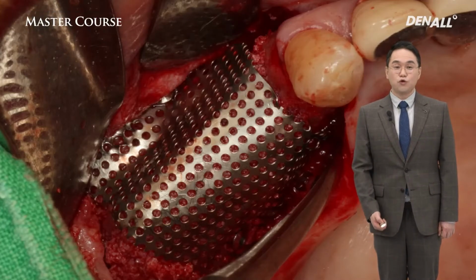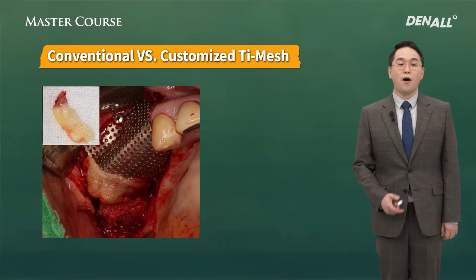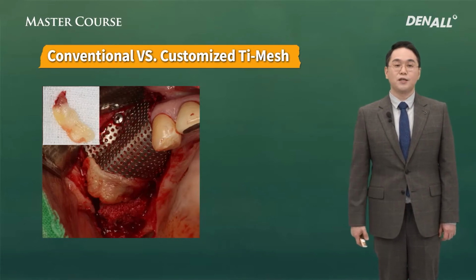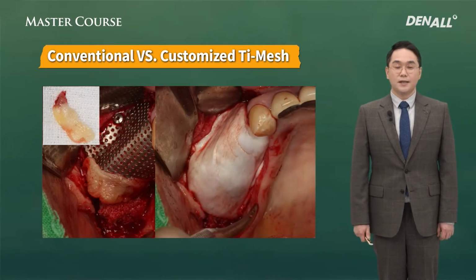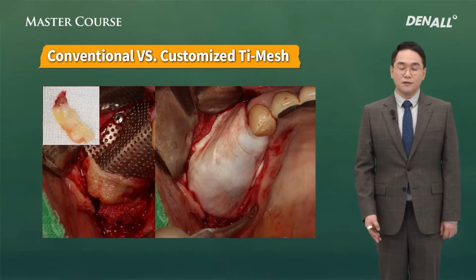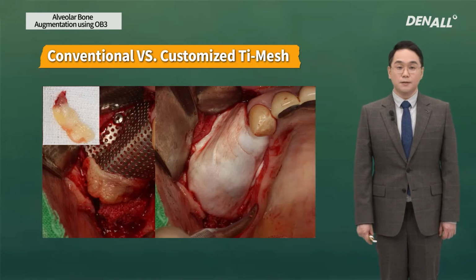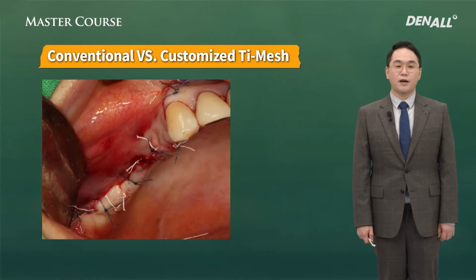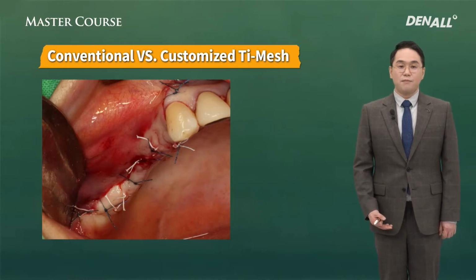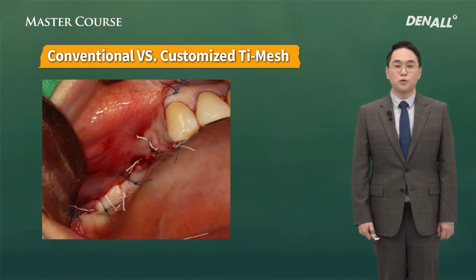The disadvantage of titanium mesh is exposure. To minimize it, we need to draw blood from a patient to make a PRF to cover the edges where exposure is a concern, and the entire titanium mesh is covered with the OSSTEM, the collagen membrane, so everything is covered. The purpose of it is to prevent the exposure, and the buccally releasing incision is made for the flap, and the primary closure is achieved, which is important for GBR as well as the bone augmentation using titanium mesh.